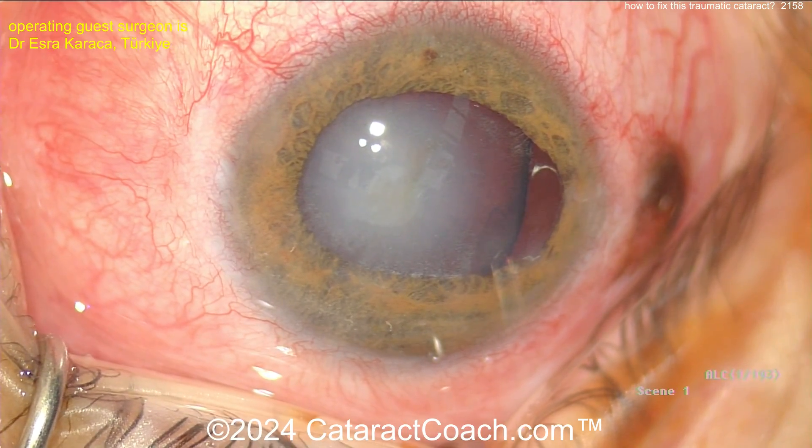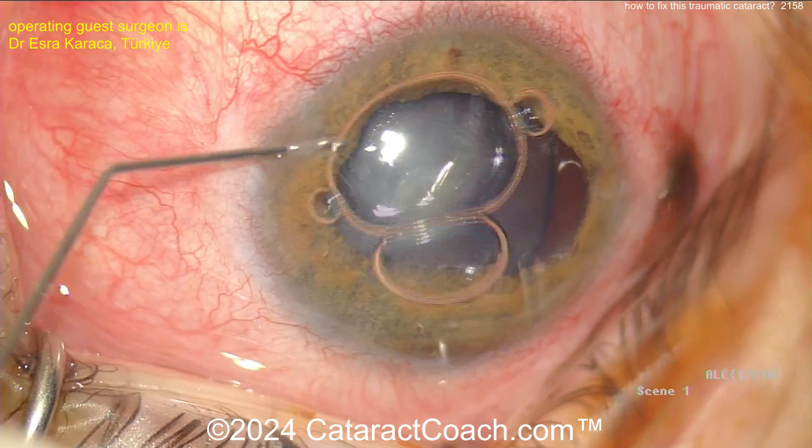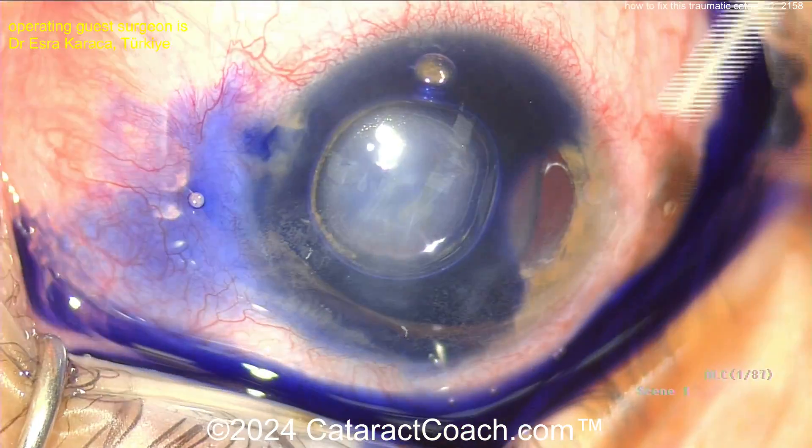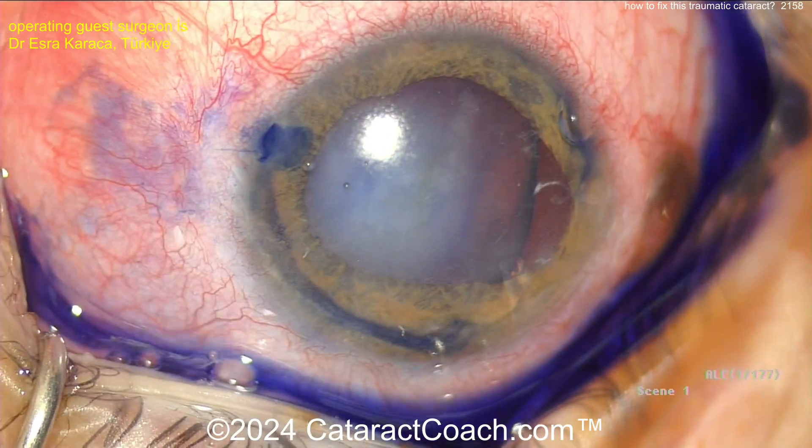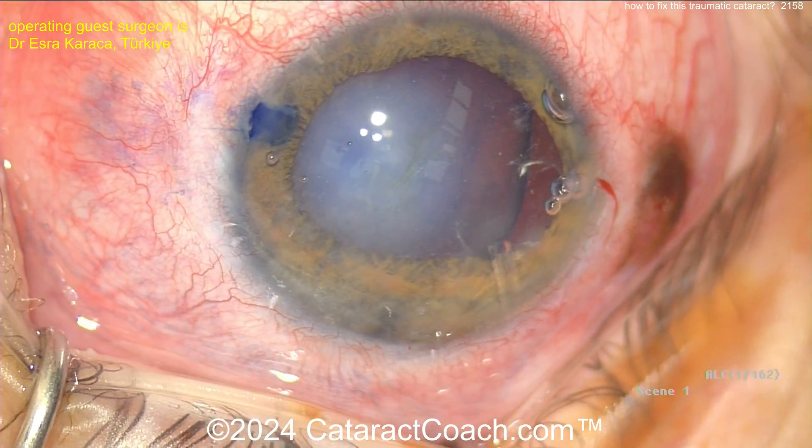Now we'll use a trypan blue dye, but be judicious — don't use too much. Because you don't want to inject trypan blue dye into that gap in the zonular support and have the vitreous cavity fill up with blue dye. That would ruin your view.